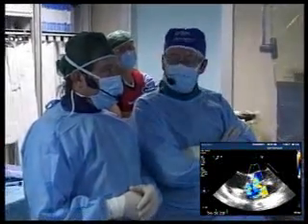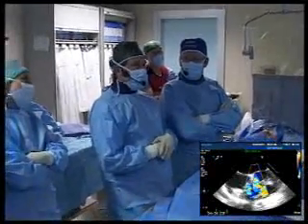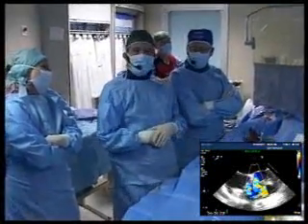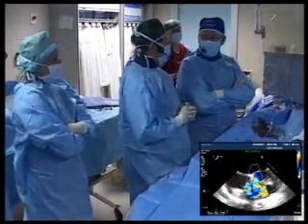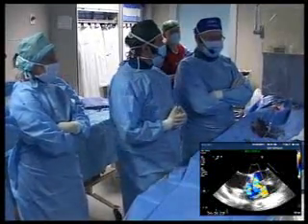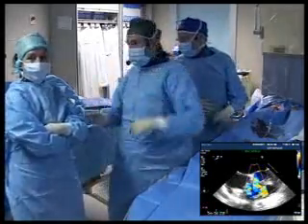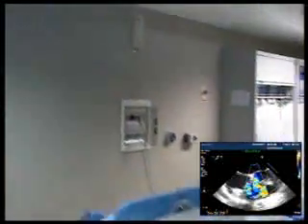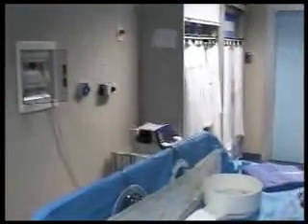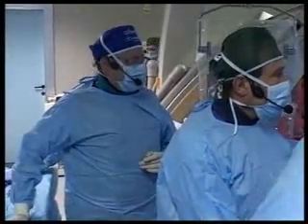Kevin: Well, actually, to be frank with you, we already decided to use a 10 millimeter device, and we are happy that the audience agrees with us as well. Thank God for that. Okay, so let's go with the camera to the table here to show you the device. Where's the device? Oh, we didn't open it, Mario. We were waiting to see what the audience said.